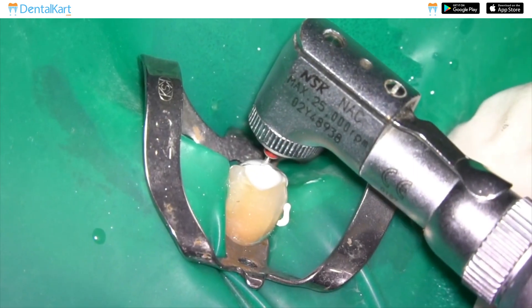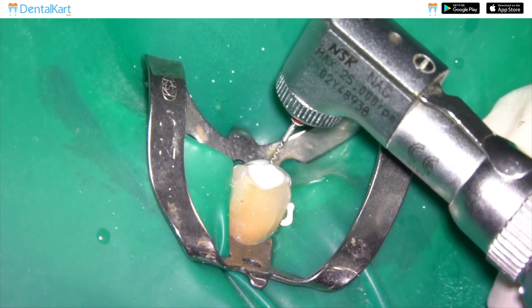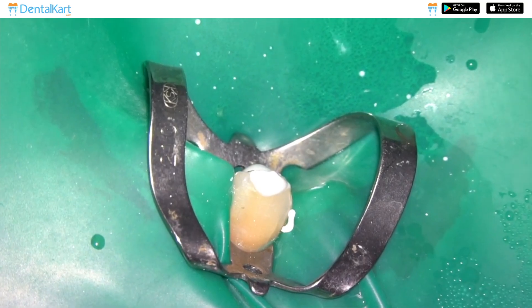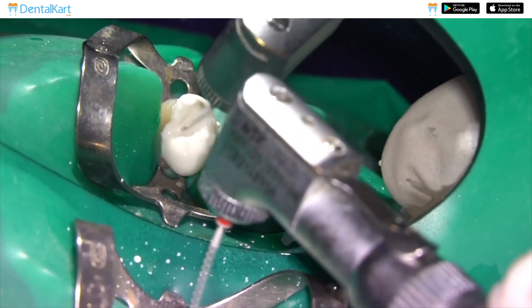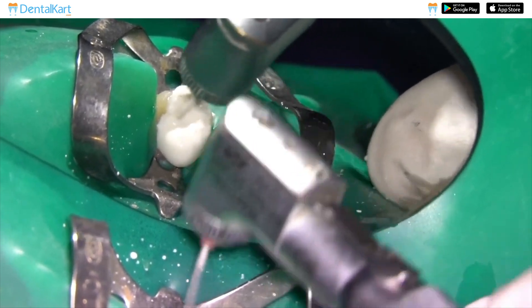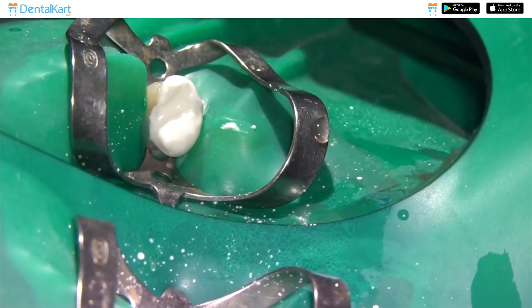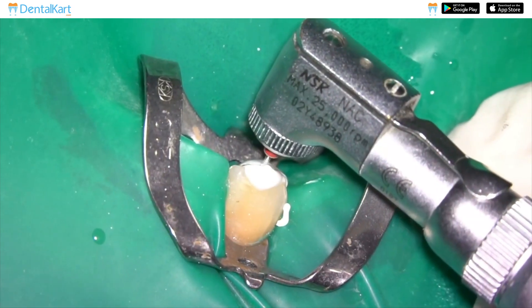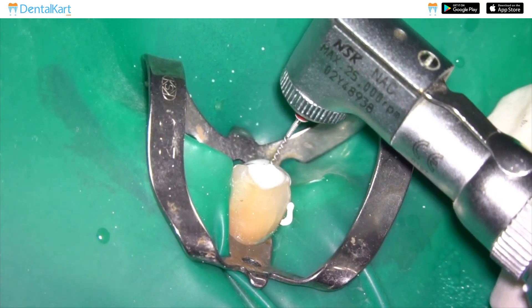Gently insert the instrument into the canal, making sure not to apply excessive pressure to avoid potential instrument separation or canal transportation. Activate the slow-speed handpiece, spinning the paste carrier at a slow speed to prevent excessive heat generation and potential damage to the tooth structure.